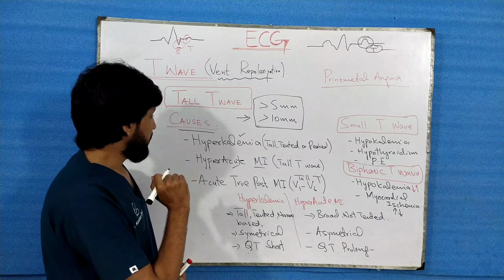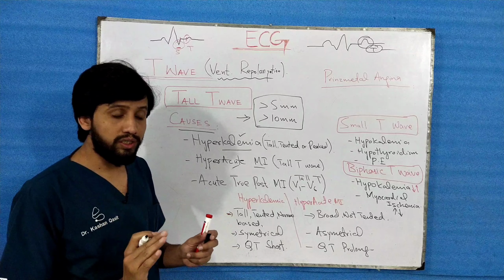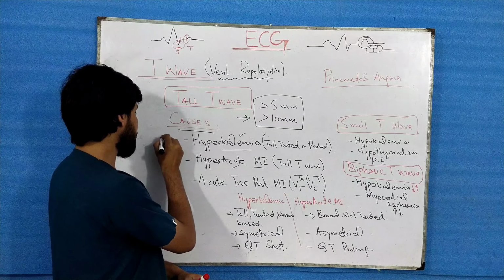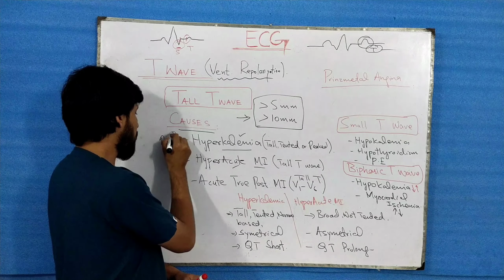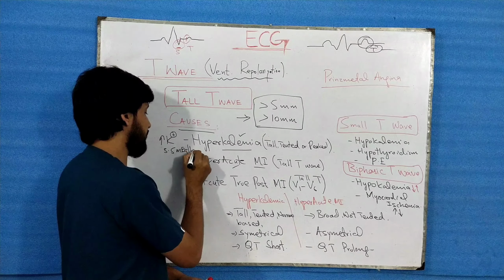In order to differentiate between these, hyperkalemia is the condition in which the level of potassium is greater than 5.5 milliequivalents per liter.